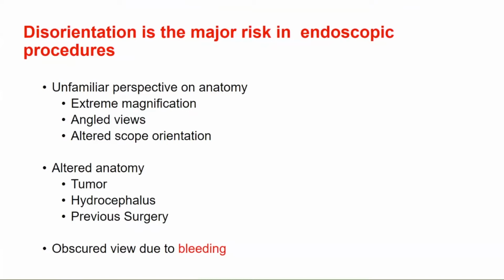Some of it has to do with how the operative setup is. You're extremely magnified, and your surgical view is focused at the distal end of the endoscope. That's obviously an advantage of using an endoscope, but it can be really disorienting because now you're looking at a really zoomed-up picture, and before you get experience in some of these procedures, that can be somewhat disconcerting.